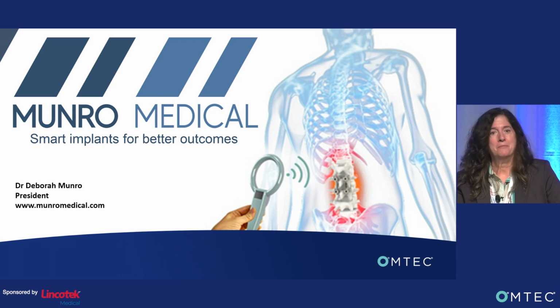non-positive impacts, including the metal hardware right in the middle of what you're trying to take an x-ray of, and also bone mineralizes over time. So there's an inherent delay if you're waiting upon an x-ray to tell you when something is fused.